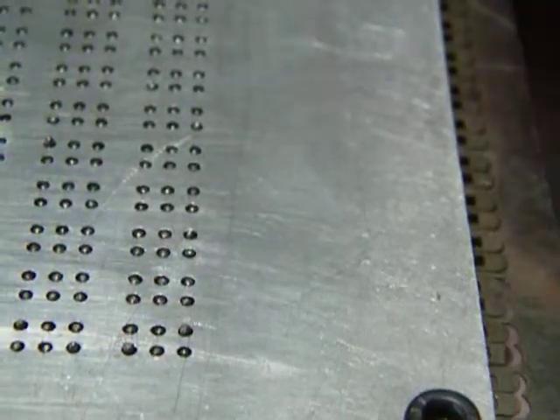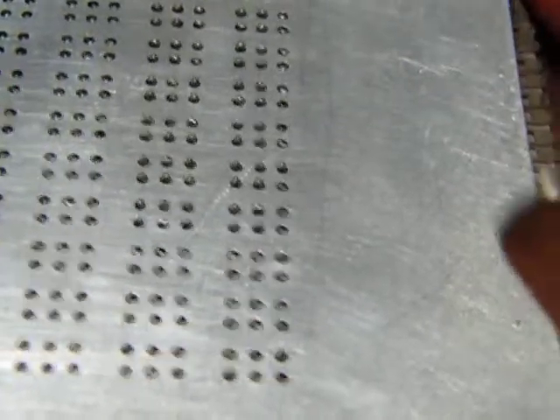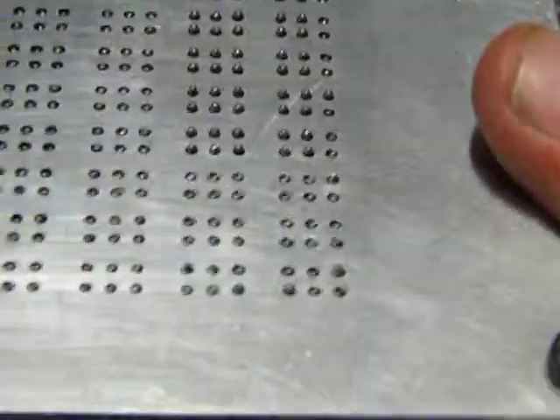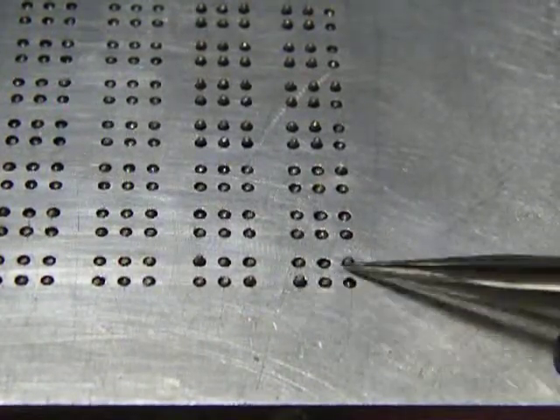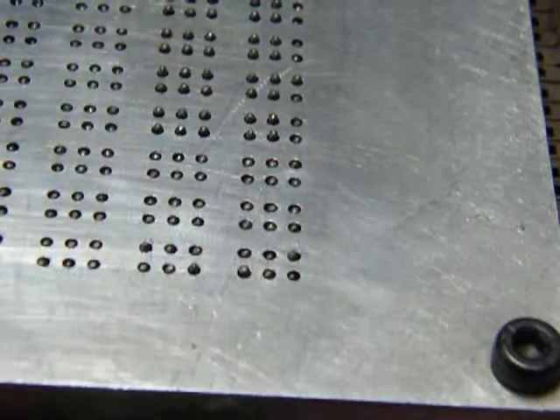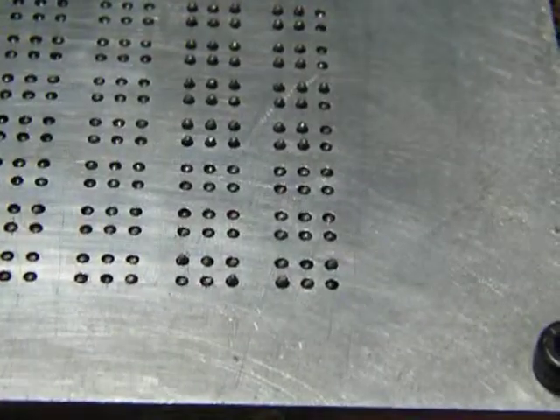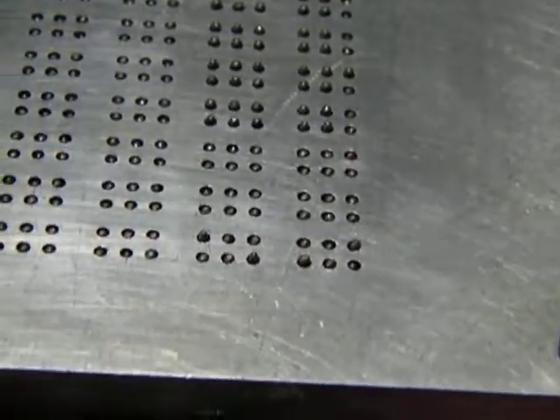Now no matter what you do with the row actuators, once they're latched, there's no activity. So you can see that you can create any set of pin combination by row and column addressing, as long as the column is done a whole column at a time for all five lines in this case. So if there's a 10 line display, it's all 10 lines at a time. So that column, you enable it and you set all the data in the entire column. Then once it's latched shut, you can play around with the row actuators for the other cells.